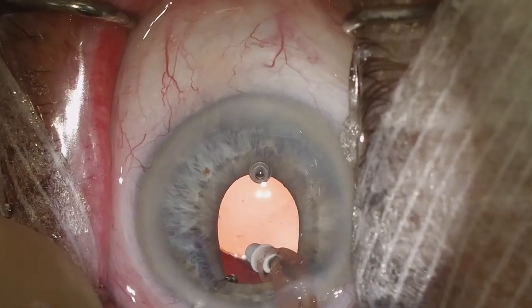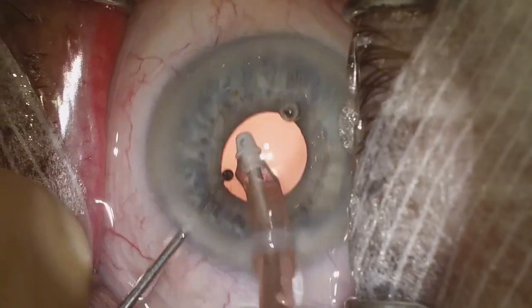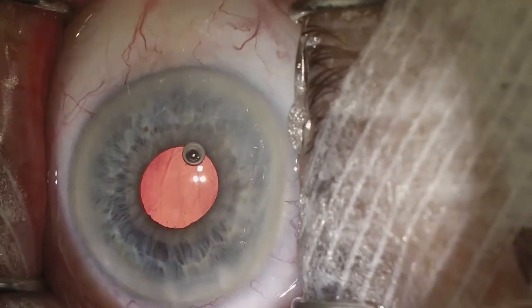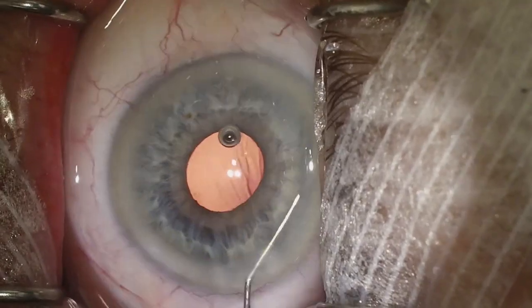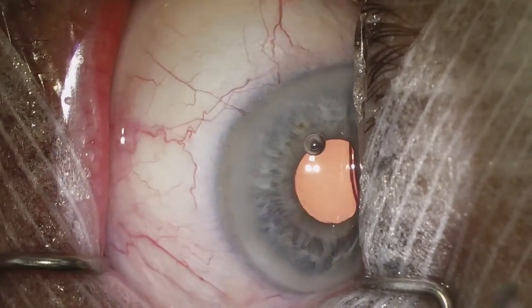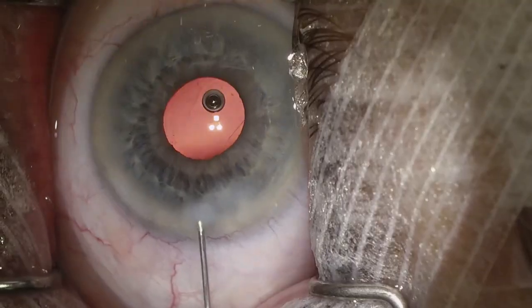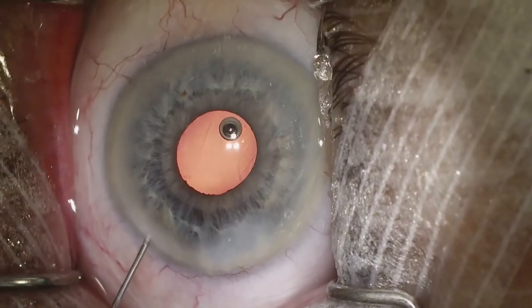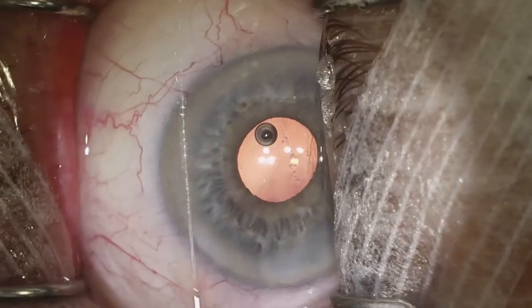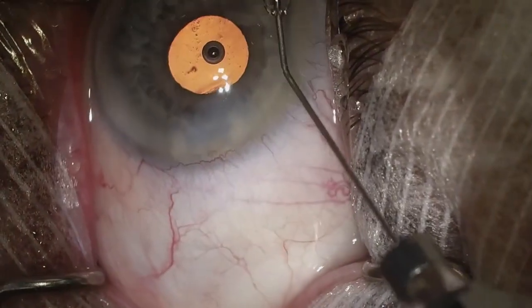At some point we have to realize that perfect is the enemy of good — we don't want to keep being too aggressive and risk a complication, especially when the remaining material is so little. We're confident we've gotten all the cataracts out with no pieces left. I'll go ahead and irrigate out again to make sure there are no pieces hiding in the angle. The pupil has already come down. Now we're just going to hydrate the wounds and make sure we have adequate pressure — hydrating the main wound first, then with the paracentesis I inflate the anterior chamber and then hydrate the paracentesis.